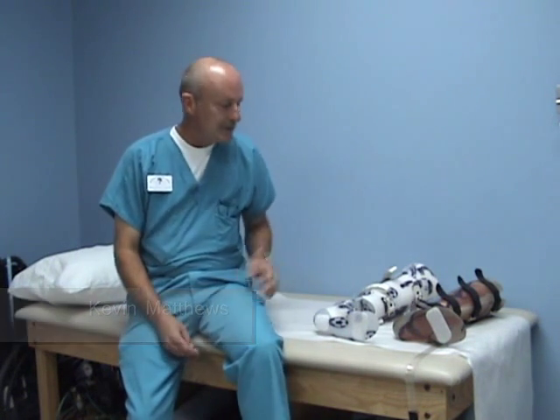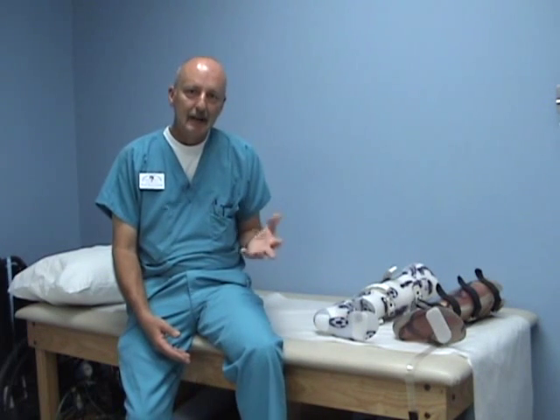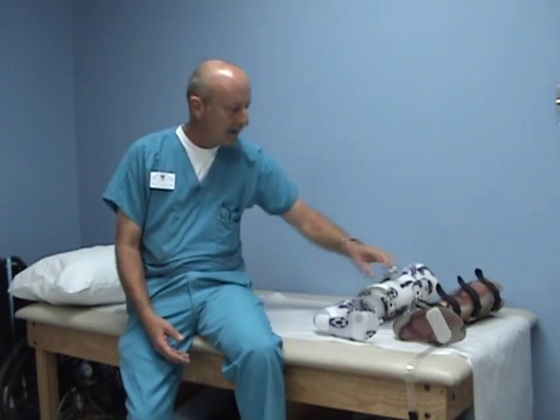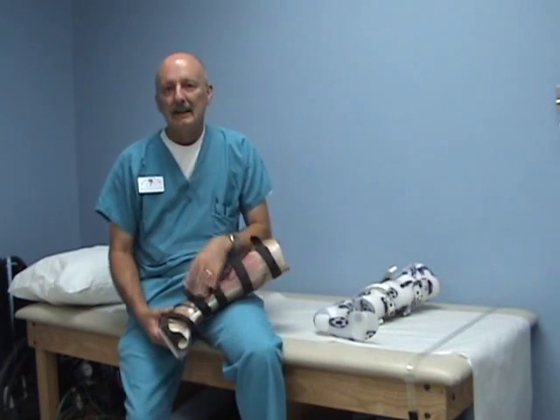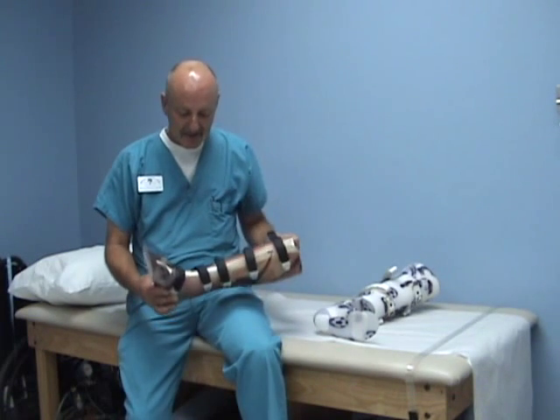Hello all, my name is Kevin Matthews. This morning a list was posted on the OMP Listserv asking a question about management of calcaneal fractures. I have a couple of designs that I use and I'd like to share them with you all as part of my series. I'd like to get some videos out there for some of the techniques that I use.